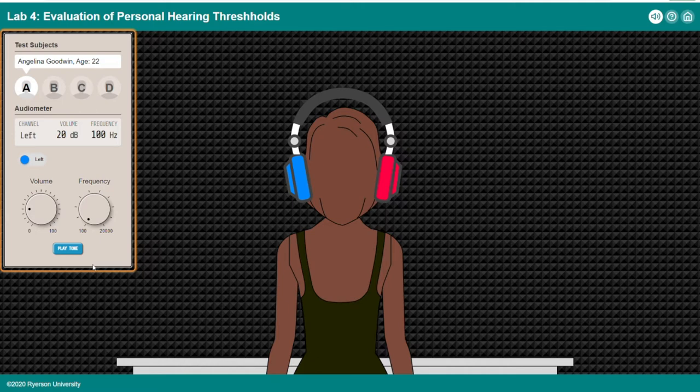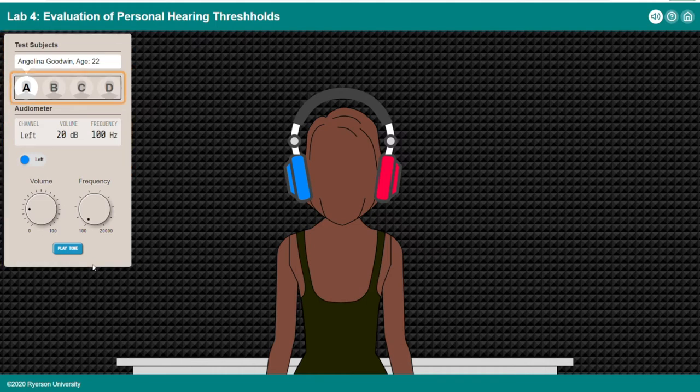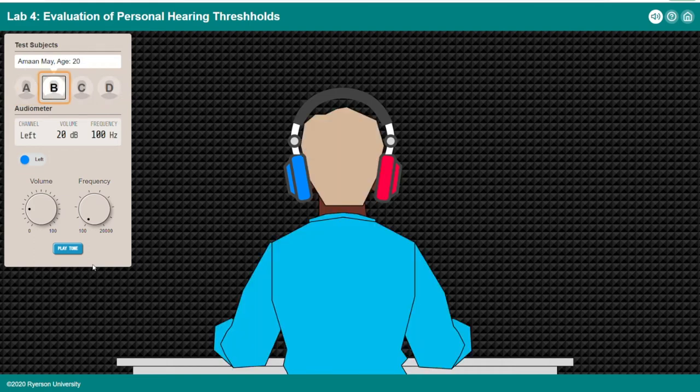Hold the space or enter key on the play tone button — the reaction of a test subject will be read while playing the tone. Test subjects list with four items: Subject A, Subject B (selected).